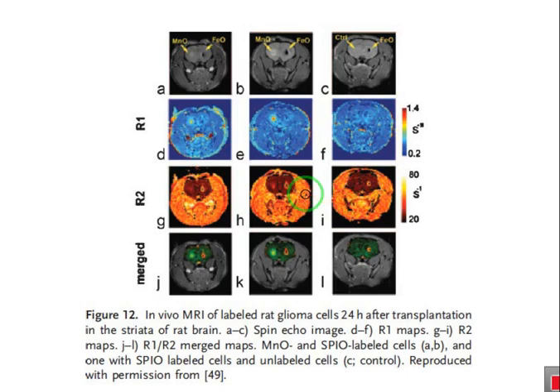And here in this example you can see that the MnO nanoparticles can be used not only for the T2, here we have the R2, forget about the differences between these, as well as for T1 contrast agents, so it can improve the quality of the MR images for both of these techniques. And don't forget that these are the MnO nanoparticles, okay? Now I just remembered that the iron oxide nanoparticles have also been used, so they have been combined to improve the image quality within both techniques.